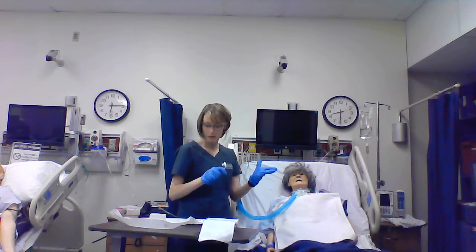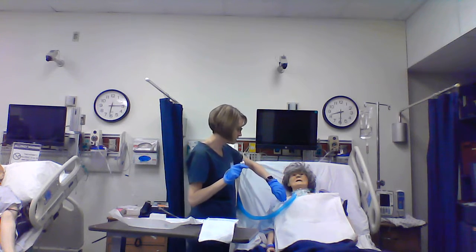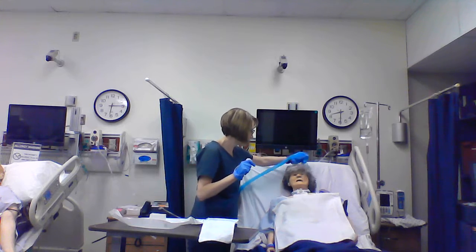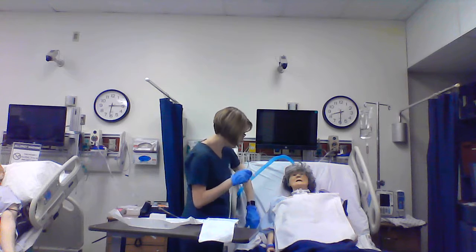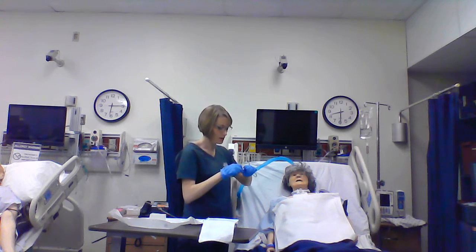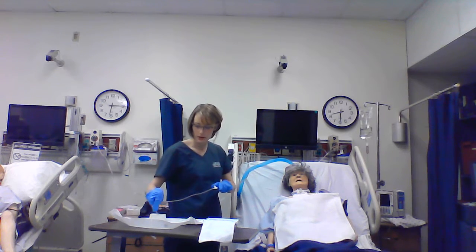Alright, so at this point I'm going to go ahead and contaminate a non-dominant hand and let Opal know I'm going to take her oxygen off. And we're going to get ready to start. So I have my suction tubing here. You can test that with your thumb. You can attach this and test your suction inside this saline if you need to, but go ahead and lubricate the tip of your catheter.